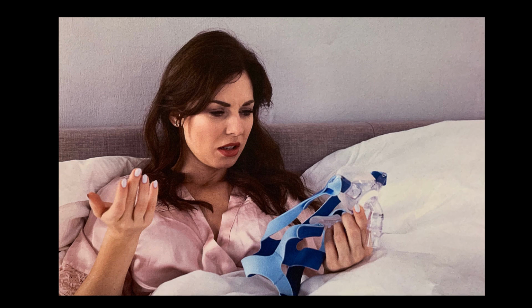And this is what we're talking about, everyone, today. It's the new Inspire treatment. It's the next level of what you do when it comes to surgery. Who is the proper candidate for surgery to begin with? It has to be a patient that it is surgery. So if someone does well with the CPAP, we don't just go to surgery. There are other procedures that are done for obstructive sleep apnea.